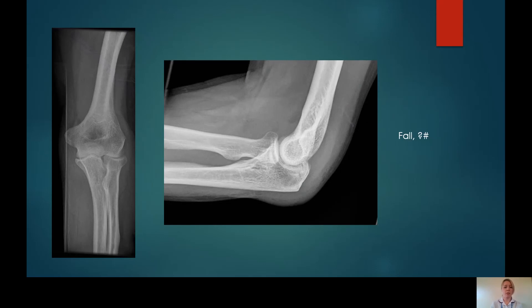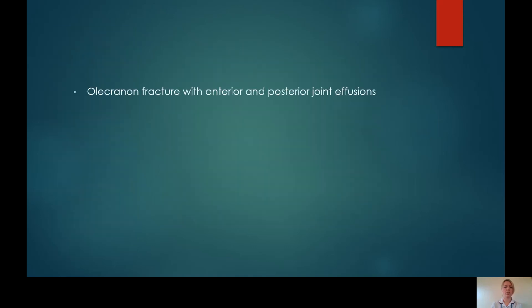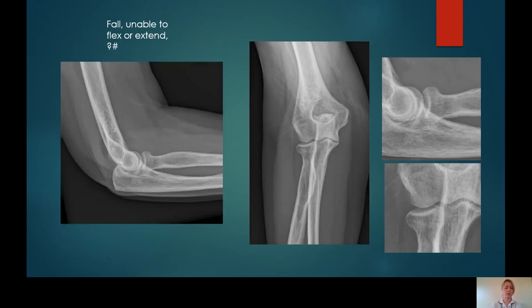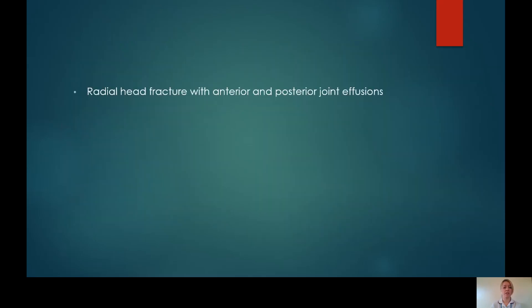What we're going to do now is have a look at some elbow X-rays — a test yourself. This person has had a fall, query fracture. In this case, you should have been able to see the olecranon fracture with anterior and posterior joint effusions present. Next: fall, unable to flex or extend, query fracture. I've included some blown up images as well. Hopefully you've been able to see the subtle radial head fracture with anterior and posterior joint effusions present.